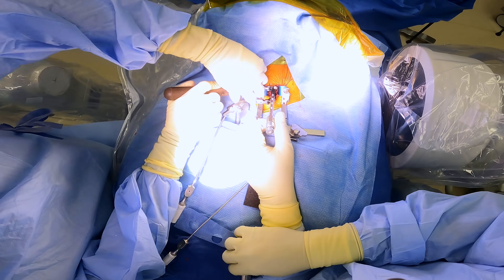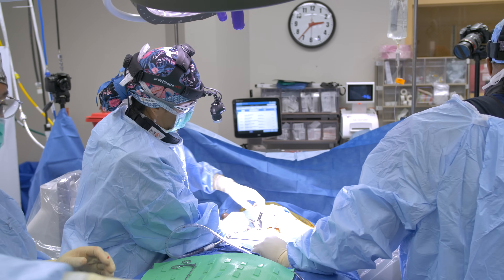It feels like a pretty good fit too. I think I'm okay with that placement there. I like that.